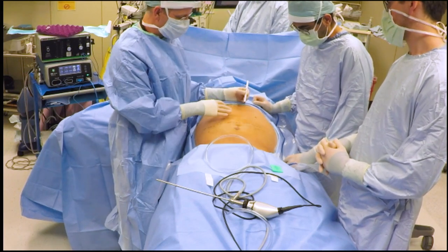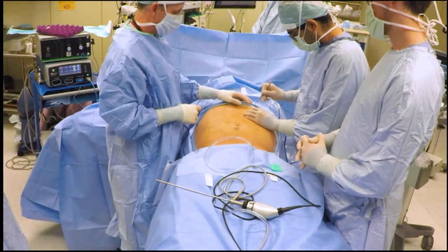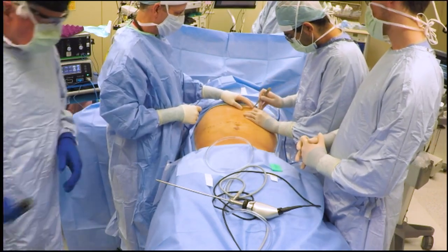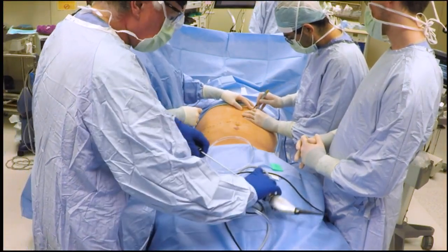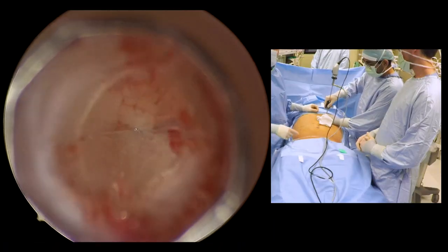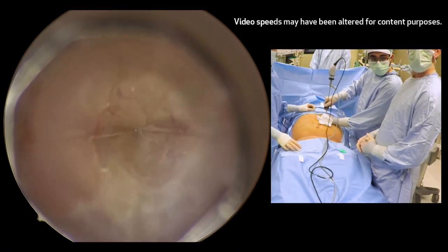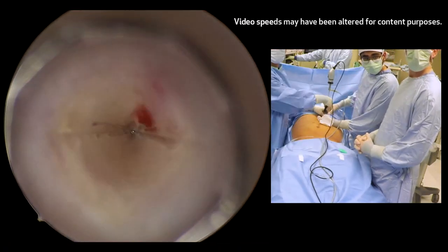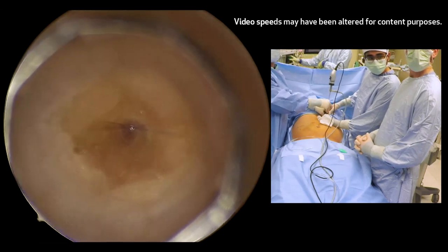Under general anesthesia, the patient is prepped from the nipple line down to the bilateral groins. Using an 11 blade, an incision is made at Palmer's point, which is 3 cm below the left costal margin in the mid-clavicular line.